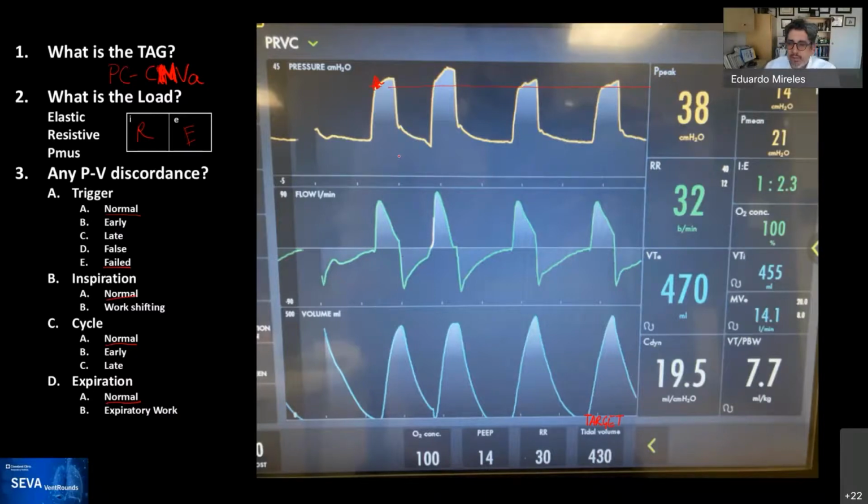It's all the resistive component. So my practice is to try to minimize the rise time or make it as short as possible. Some ventilators set it by time and some by percent. So I try to reach either 0 of time or 100% as fast as possible.